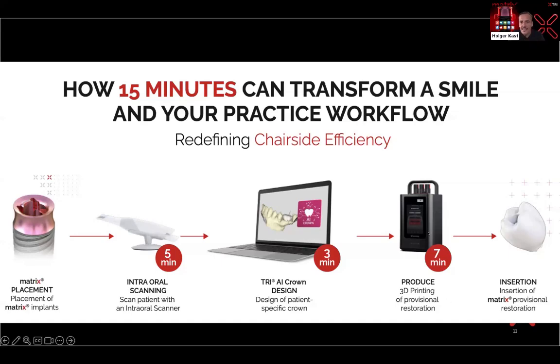But then you take this STL file, you drop it in a nowadays printer. In this case, it was the Midas printer. It prints a crown in about 7 minutes. And then you just screw retain this crown in the patient's mouth, these days as a temporary, but there are materials out there, and I'm quite sure Andrew will also talk about materials, which you may be able to use for final restorations.